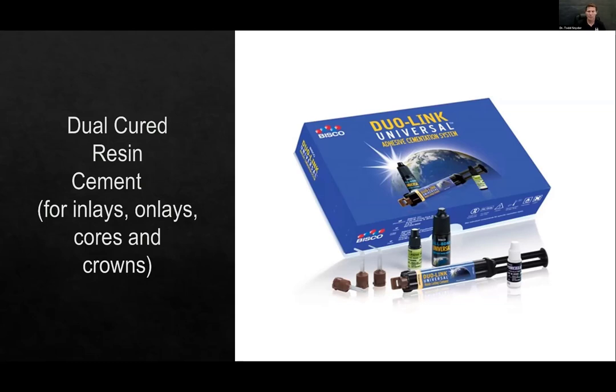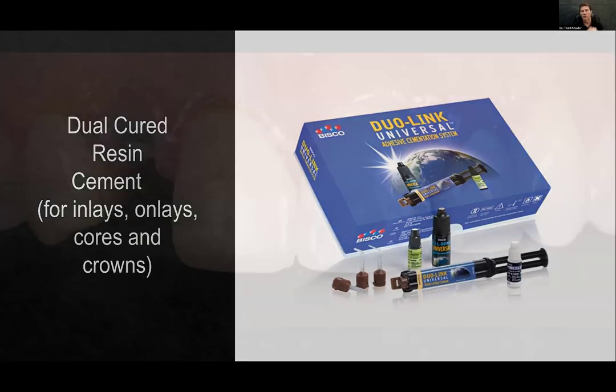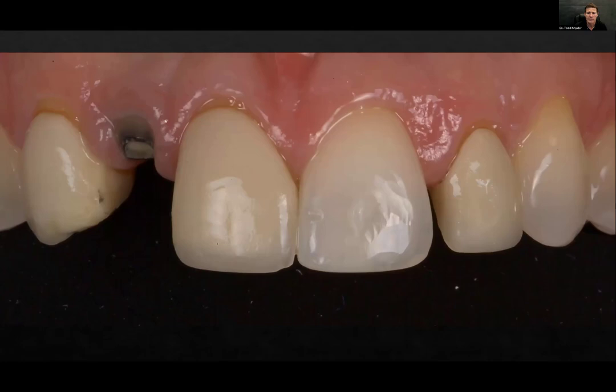Okay. So I just want to make sure that distinction is clear. If we're using all the other porcelains, it's really no different. The technique's basically the same. All right. So let's talk about this. If we were doing zirconia, how is that going to be different?